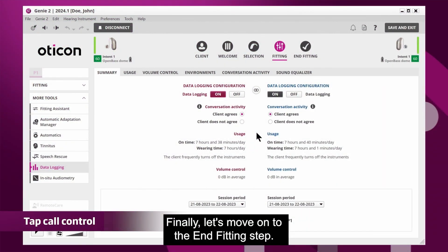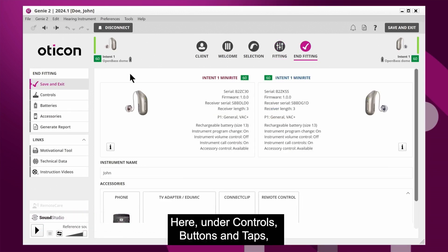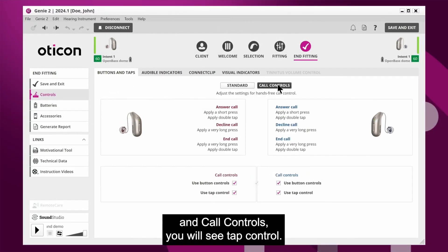Finally, let's move on to the end fitting step. Here, under controls, buttons and taps, and call controls, you will see tap control.